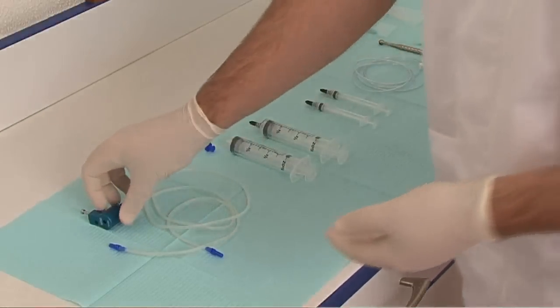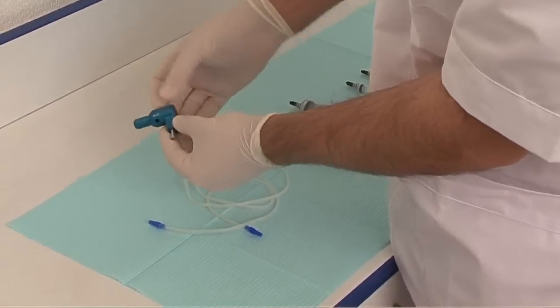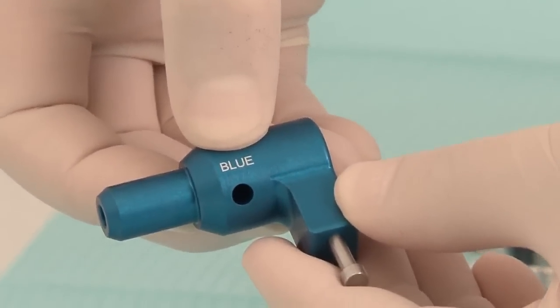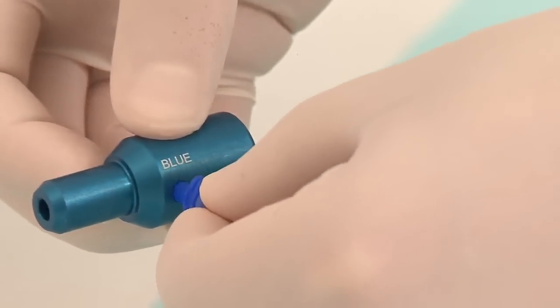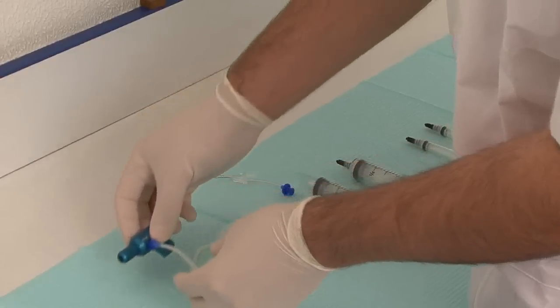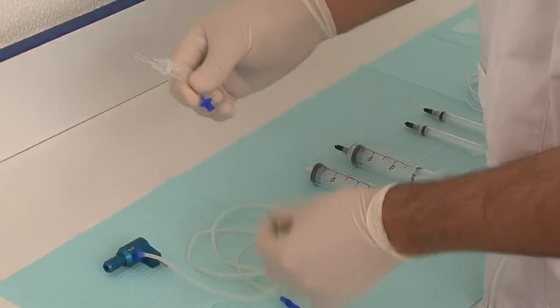We start with the multi-port adapter that is going to be connected to your surgical suction. First, as we can see here, it's written in blue, and we adapt the blue plastic from these first tubes. And this part is connected to the internal vacuum. The second part of this plastic tube, we connect it to the main delivery system of the big syringe.